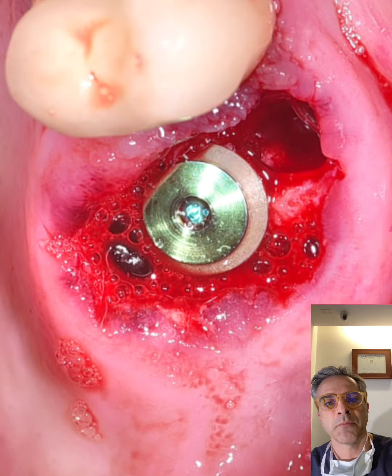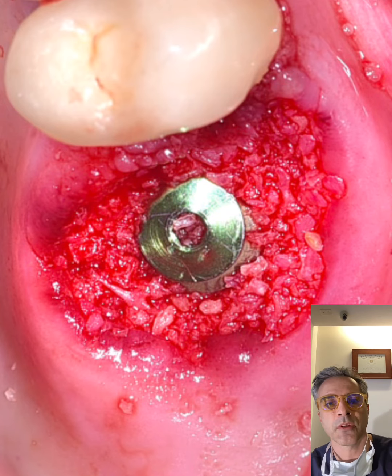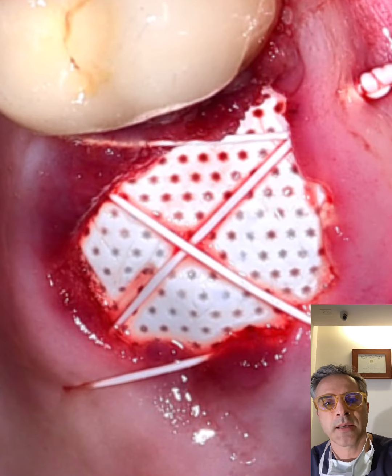I placed a 9 by 5.8 millimeter implant with a torque of 70. Allograft 70 to 30 was introduced and packed around the implant, and I used a Cytoplast membrane and secured it with PTFE suture.